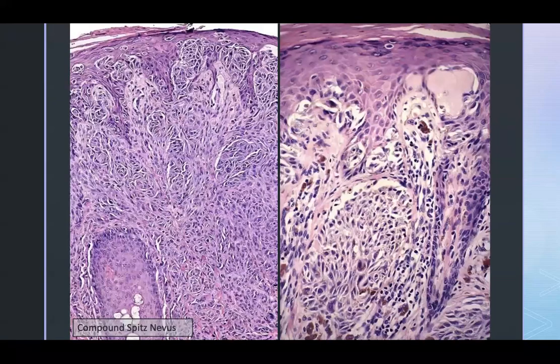Now, if you were to stain this for a panel of immunohistochemical stains, what would you do? So you could do a SOX10 and a Melan-A just to prove it's melanocytic, because there could be some mimickers, but that's of low priority. But let's say that's the first thing you do, a SOX10 Melan-A just to prove that it's melanocytic because of the eosinophilic cytoplasm. There could be mimickers.